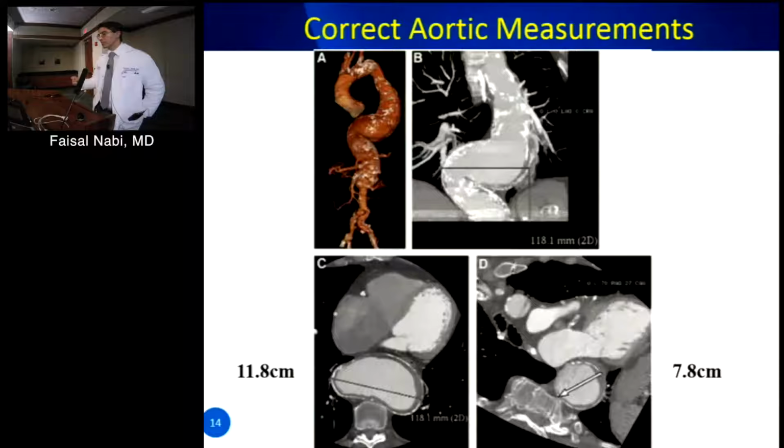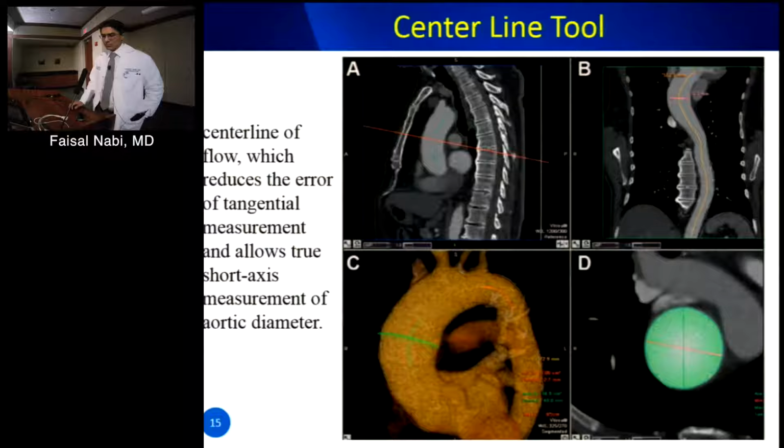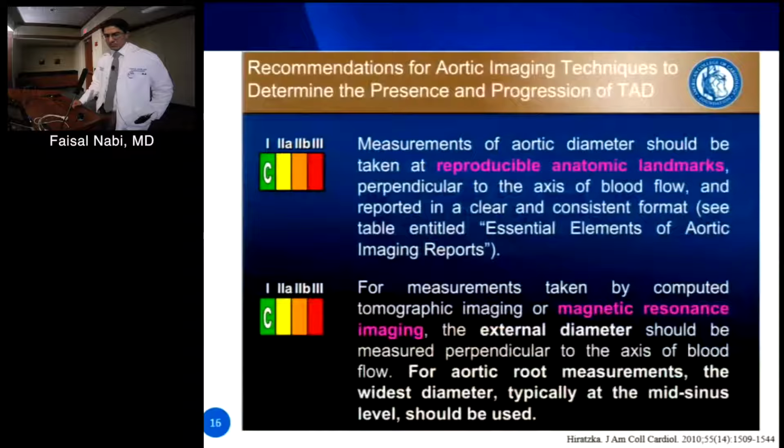I think the problem with echocardiography is why you use inner or leading edge to leading edge. Most of the time, the trailing portion of a structure is very difficult to decide where it is. You have the anterior portion of the aorta and the posterior portion of the aorta. The measurement is not a problem in the anterior portion; I can define the anterior surface. The trailing edge is the most difficult. That's why you go either leading edge to leading edge, meaning you bypass this issue and still underestimate by the thickness of that material, or you go inner to inner, and obviously you make it even worse.